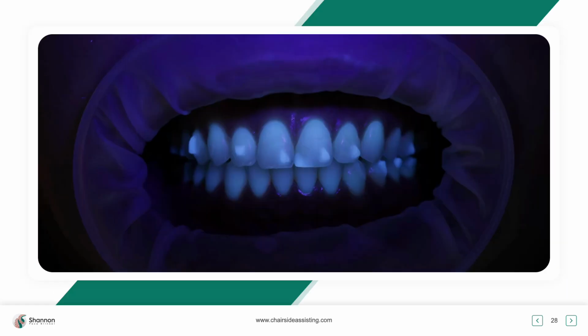And so this is where, looking at this and seeing the fluorescence, being able to see exactly how to remove those attachments, I'll make sure that you have this. It's about a 15-minute learn, but here you'll see that it is fluorescent. We can shine a light in there, and we have confidence knowing that we're doing things right.